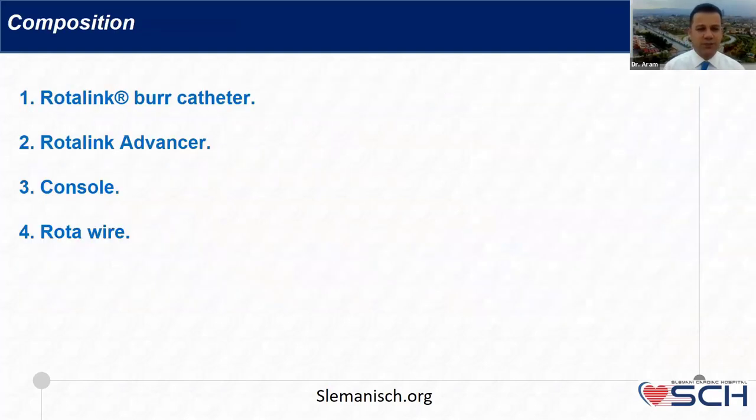Just to know the parts of the rotablator, I'm sure that a lot of people, especially John and doctor, don't have a chance to work in a cath lab dedicated to the rotablator. I will try to talk very easily about the components and how to implement them in your cath lab.